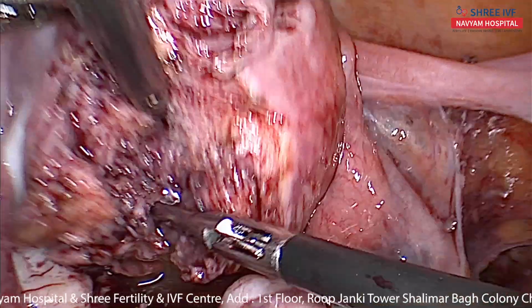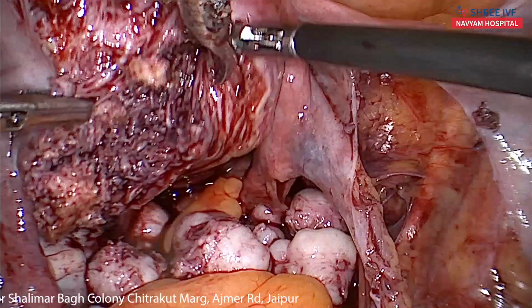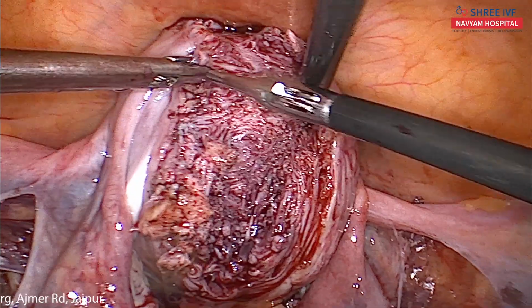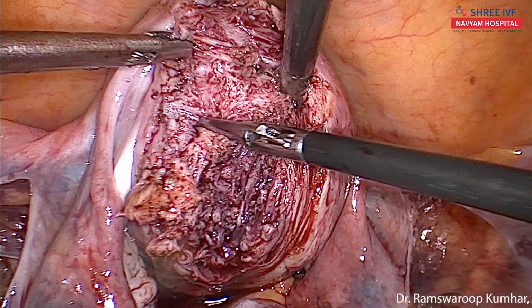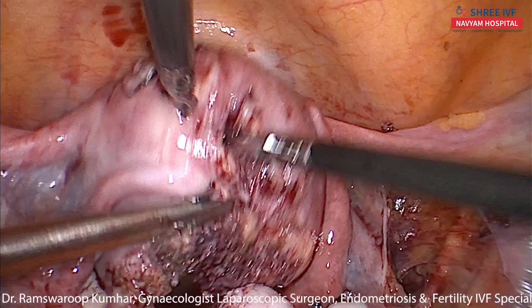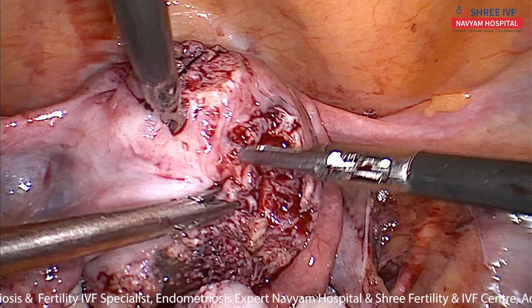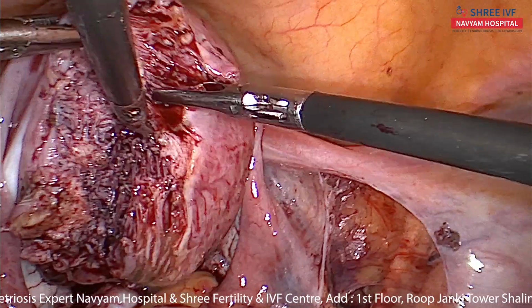This is the cavity bulge. Boggy feeling. Take the grasper and feel that. I think there should be no myoma. No, this is adenomyotic tissue at the fundus.